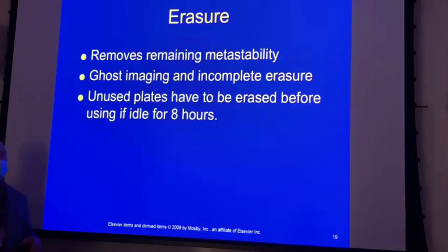Yeah, well, I didn't either until I actually saw it one time, and there's no rhyme or reason for why it does it. Because it does seem to happen at very low exposures. Was it outside of the collimated area? Yes, it was. But it doesn't happen every time, so you can't predict it.